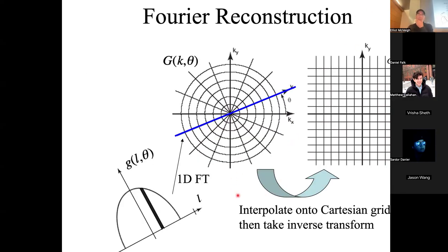So those of you who like Fourier space are probably wondering, well, if I now have this g(l,theta), which is a projection of my object, and it's a sample of my image that I want along a line in Fourier space, why don't I just sample these at different angles, creating multiple angle samples, and then do the inverse Fourier transform to create the picture, right? Because I've got the Fourier space of my image. That's pretty darn close to your image, right?